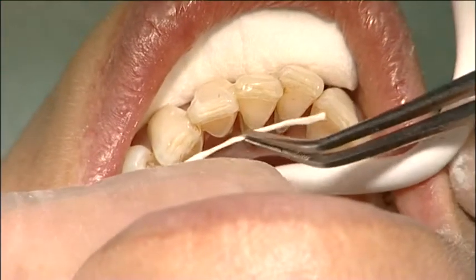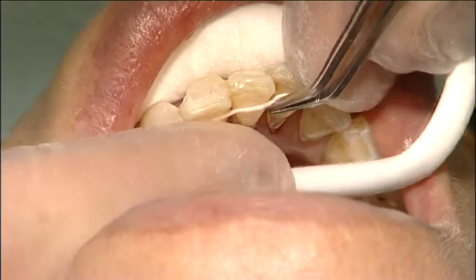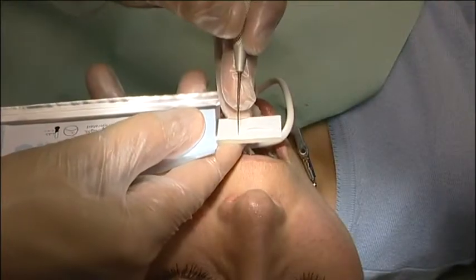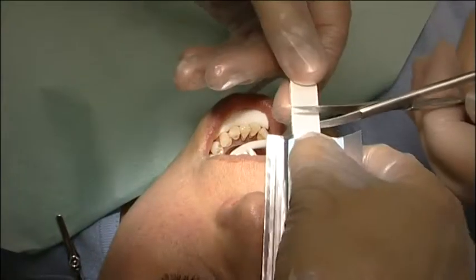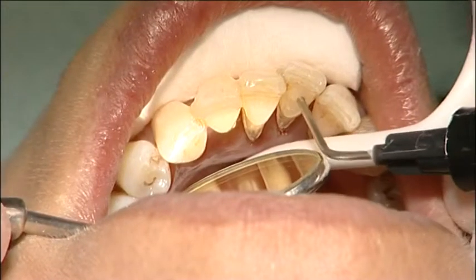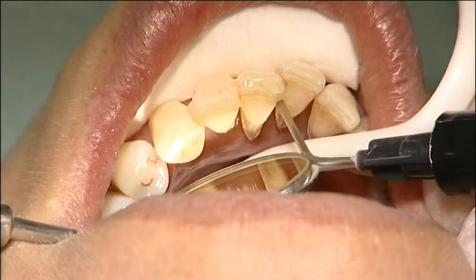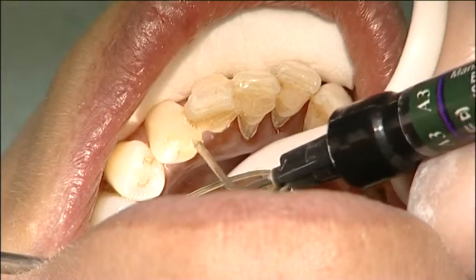The needed length for the fibre was measured and cut. A continuous thin flow layer of 0.5 millimetres was applied on the lingual tooth surfaces. Do not light cure the composite at this point.